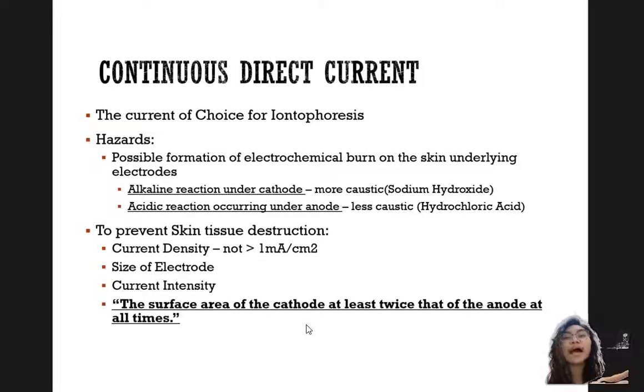So, therefore, ang mangyayari kasi, we would have an active electrode and an inactive or dispersive or indifferent electrode. Pwedeng alin dun sa tatlong yun yung tawag nyo sa kanila. Ibig sabihin, yung isa may gamot. Yung isa, ilalagay nyo lang somewhere sa body para lang makomplete yung current, for the sake of completing the current. And that's it.